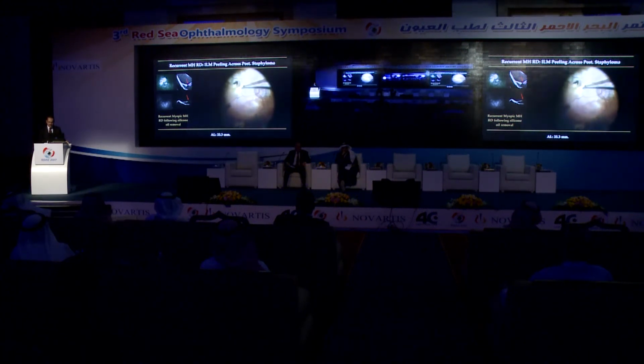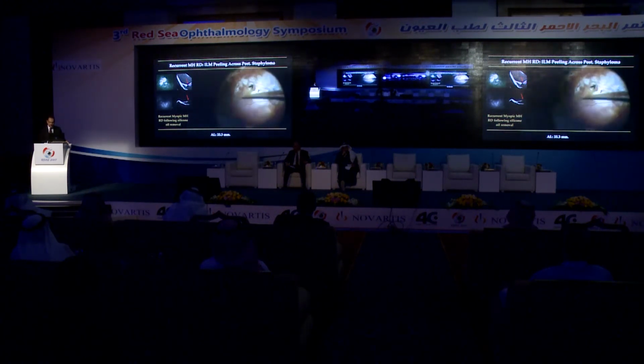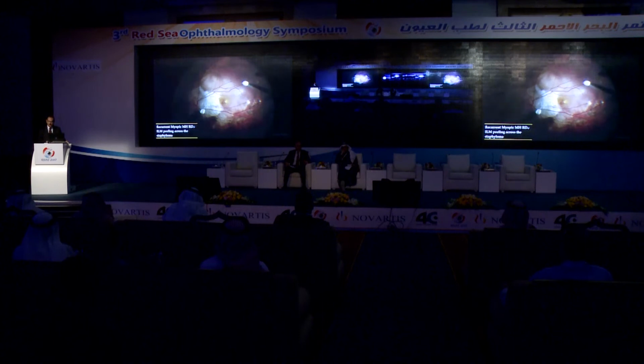the eye was filled with silicone oil for a long time, and we all know that the internal limiting membrane is difficult to remove once the eye was filled with silicone oil for a long time. The internal limiting membrane was completely removed, and this is the post-operative picture. The retina is attached and the macular hole was closed. So these are the results of working only with removal of the internal limiting membrane.